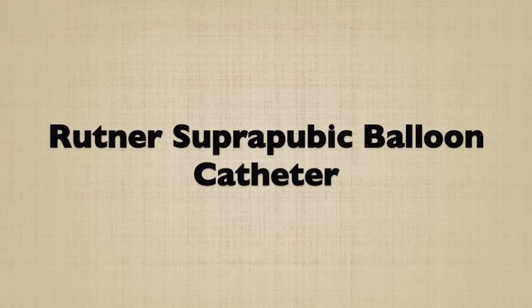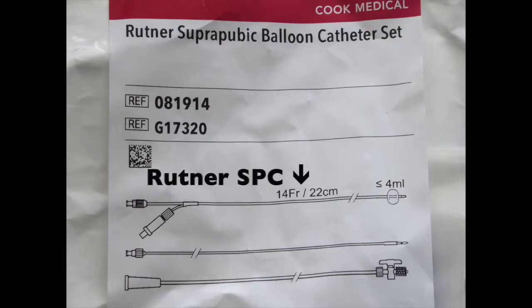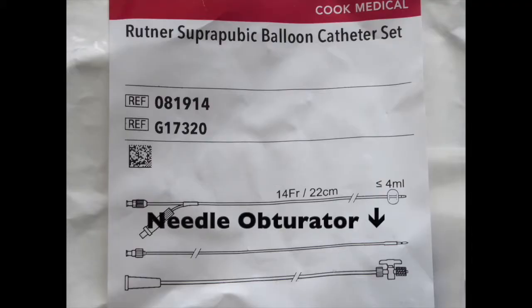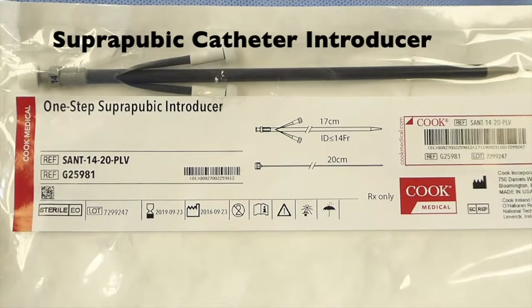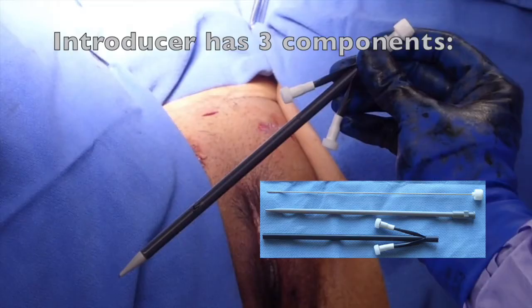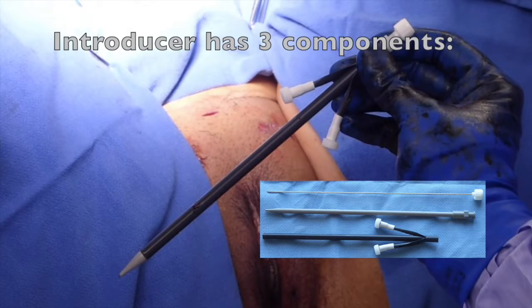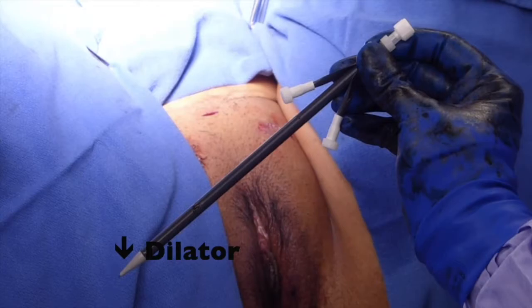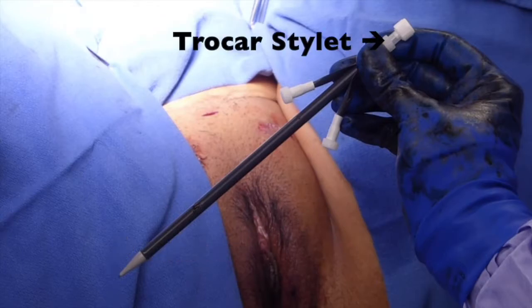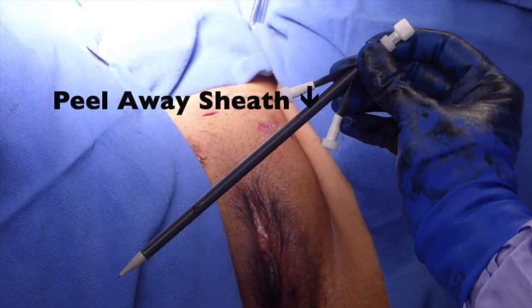The Rutner suprapubic balloon catheter uses a needle obturator and an introducer for insertion. The introducer has three components: a dilator, a trocar stylet, and a peel-away sheath.